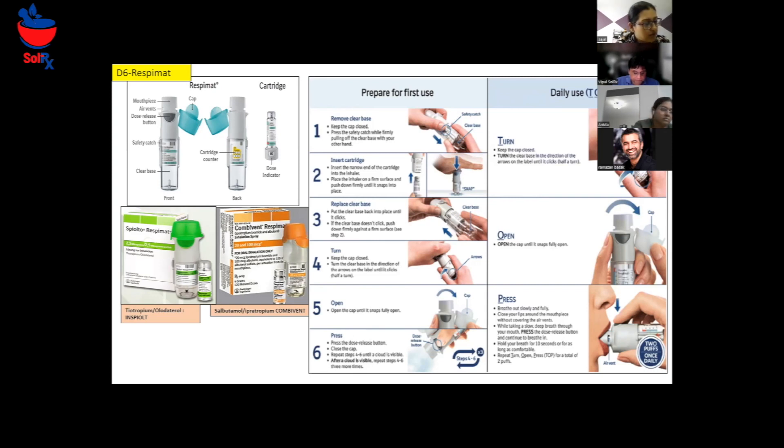Remember to store it in a cool and dry place — not in a washroom and away from sunlight. Keep it away from pets and children as well. You can also clean the inside of the mouthpiece with a dry cloth. You can check the dose indicator to see how many doses are left.